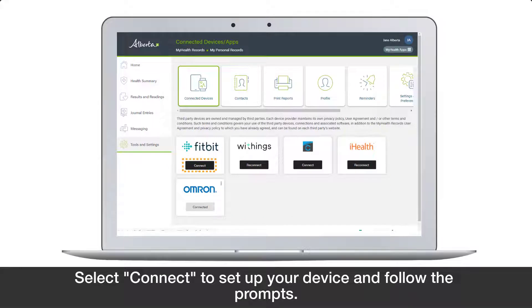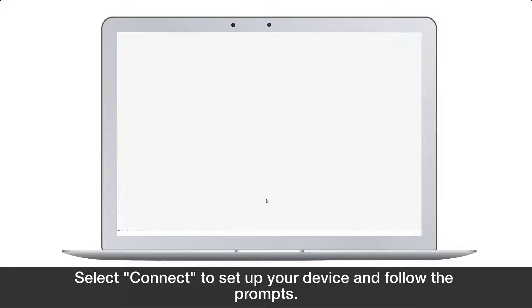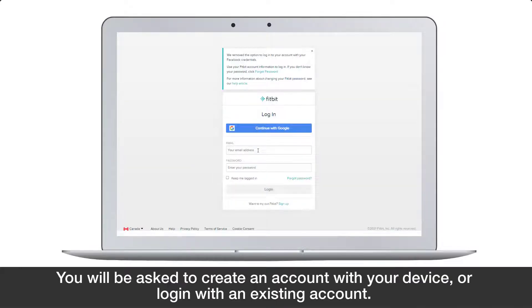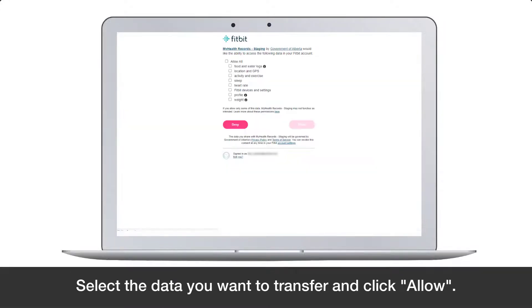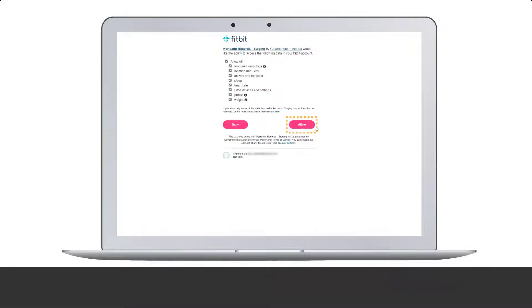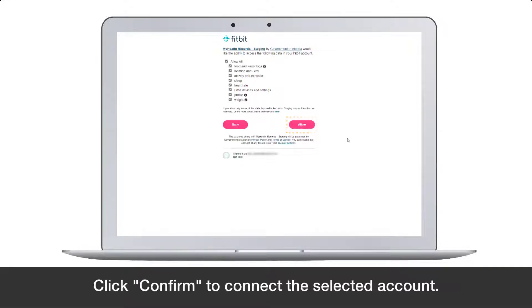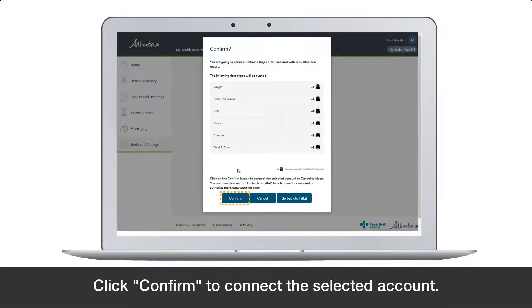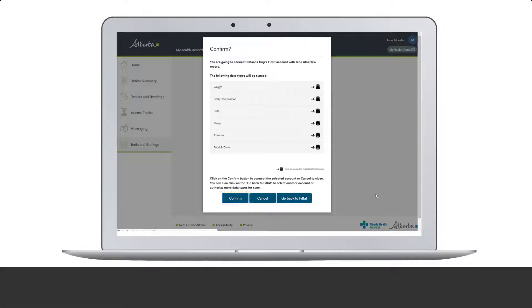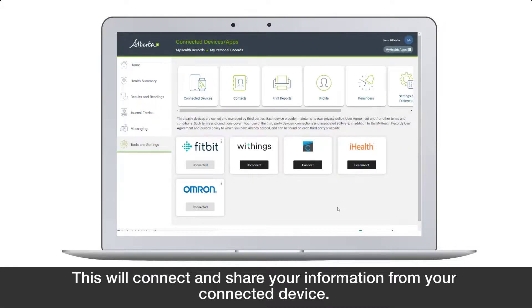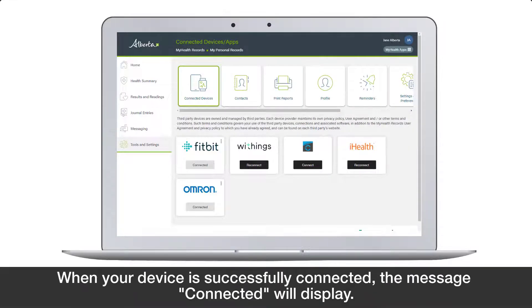Select Connect to set up your device and follow the prompts. You will be asked to create an account with your device or login with an existing account. Select the data you want to transfer and click Allow, then click Confirm to connect the selected account.